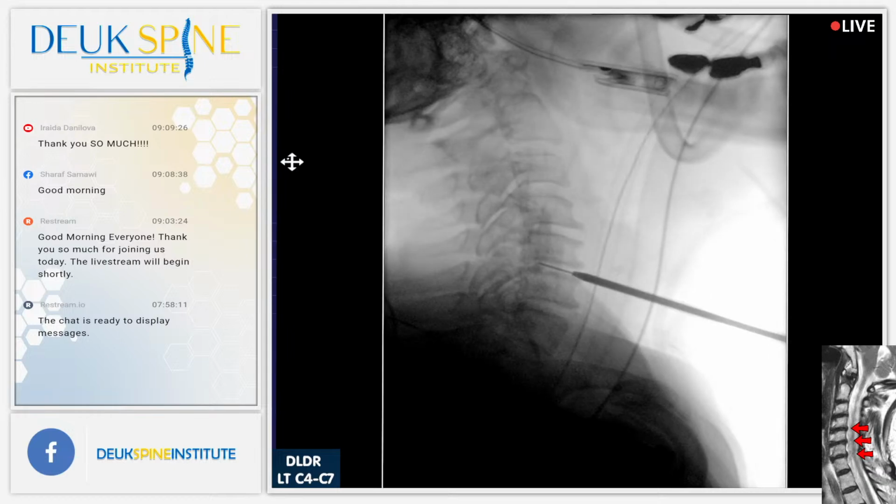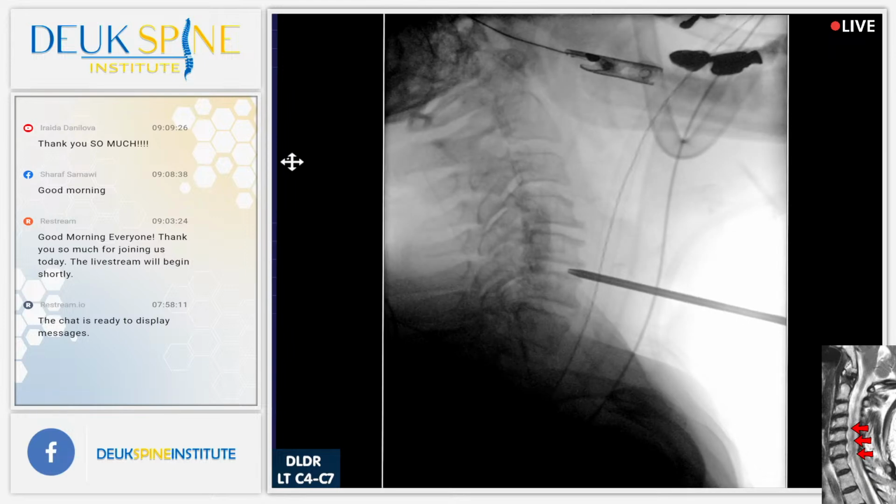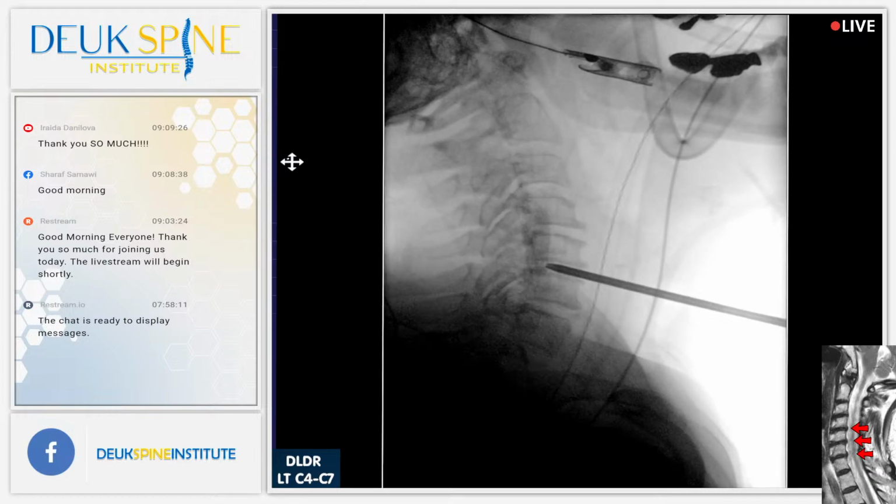All right, so I'm entering the annulus now. I'm going to take the guide wire out, and I'm going to advance my dilator through the disc all the way to the back where the herniation is. Shot. Now she has degenerative disc disease, for those of you wondering.